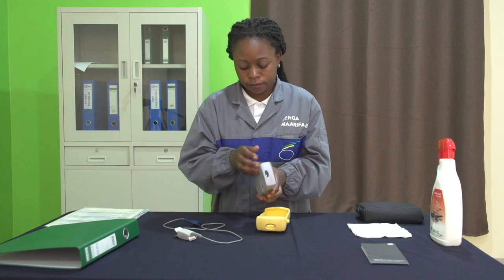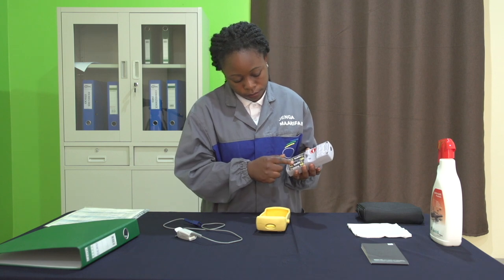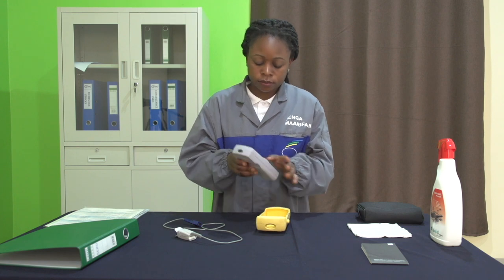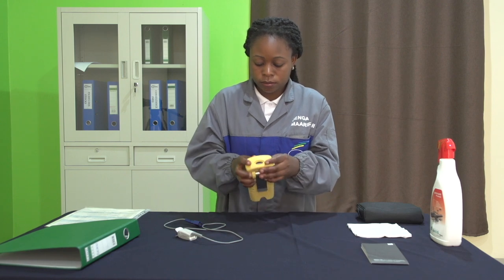Pour la batterie, ici on a un appareil portable. On va vérifier que la batterie est en bon état. Si l'appareil a du mal à s'allumer, on va changer les piles. Si notre appareil est muni d'une imprimante, on va faire un test d'impression.